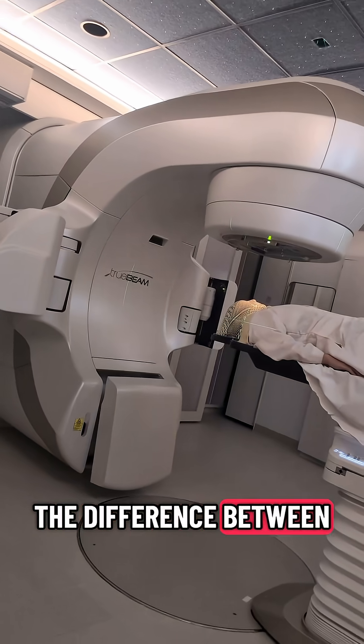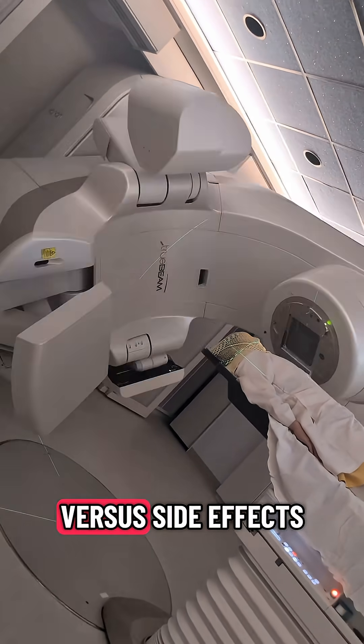This precision can often mean the difference between side effects you can heal from versus side effects that are permanent.